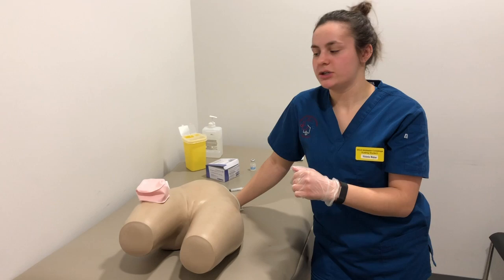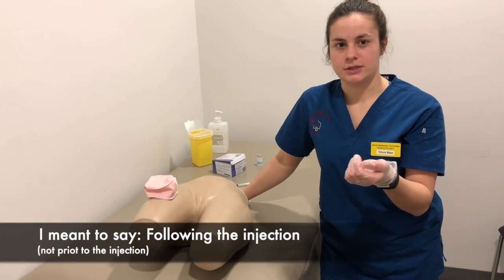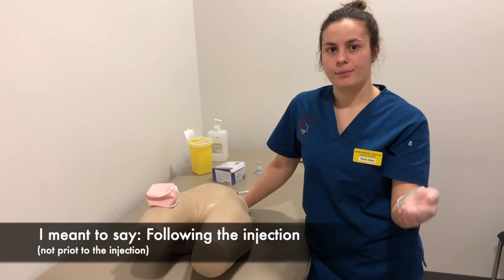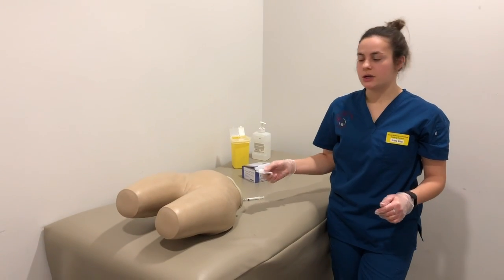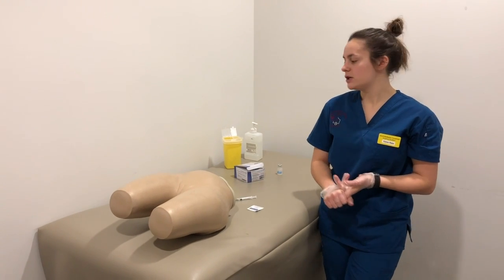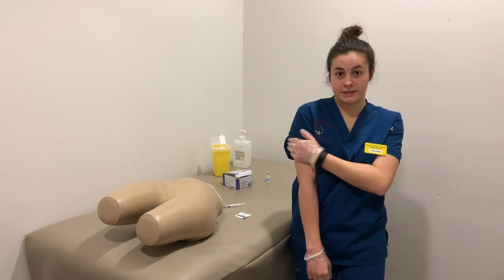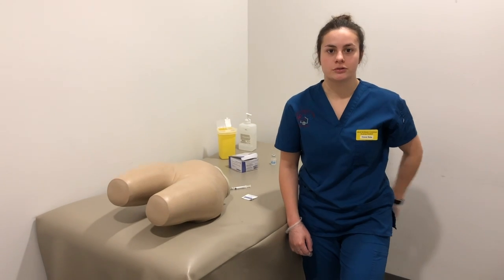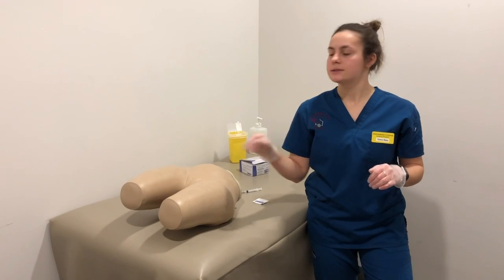Heparin is an anticoagulant drug, so you want to make sure that you don't press or rub the spot that you injected it into, just because you don't want to cause bruising or excessive bleeding to the patient. The next medication I will be injecting is the intramuscular. This is the Haldol for the patient. The spots that are appropriate for intramuscular injections include the deltoid muscle on the arm, the vastus lateralis on the leg, and the ventrogluteal. I will be injecting into the vastus lateralis.